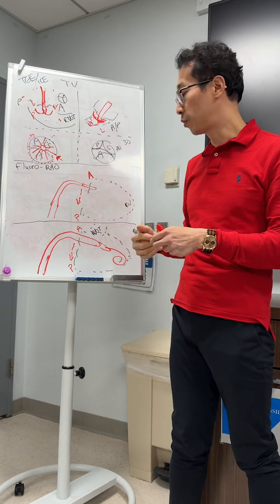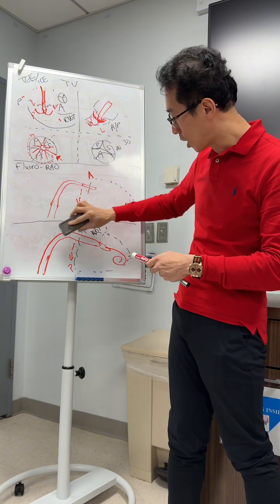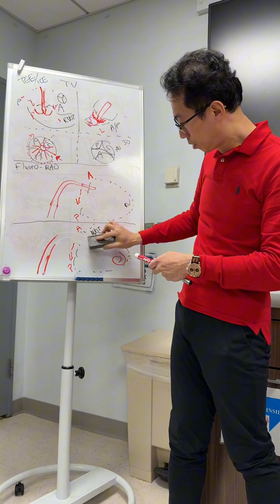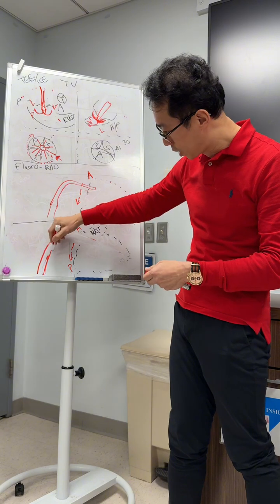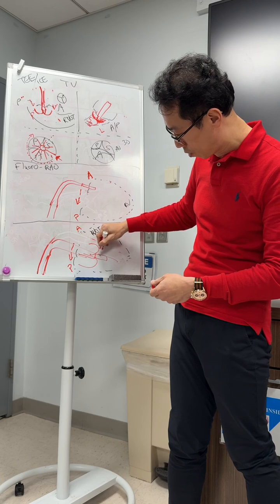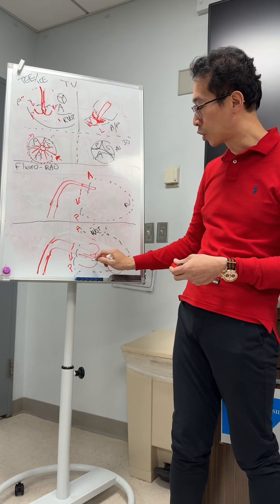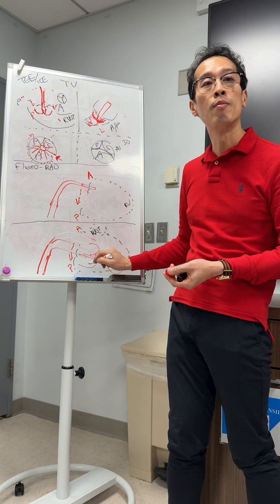Okay, and for here on the imaging side, let's just clear this up. Let's put the device in the middle. You have your anchor now exposed. This is your nose cone, and then your wires here. So here you can also check for other objects, right? If there's a CIED lead, you should be able to see its immobility.